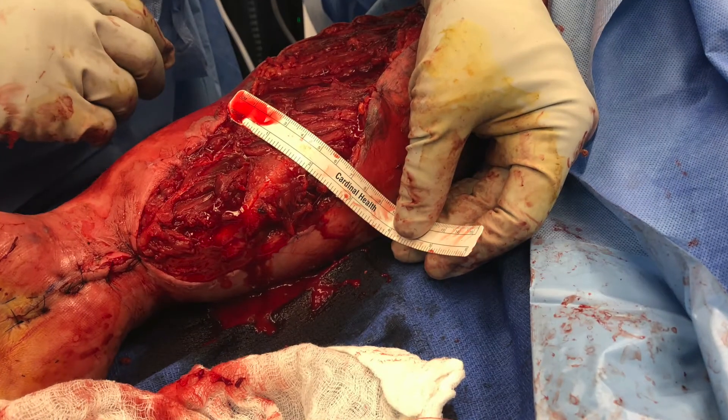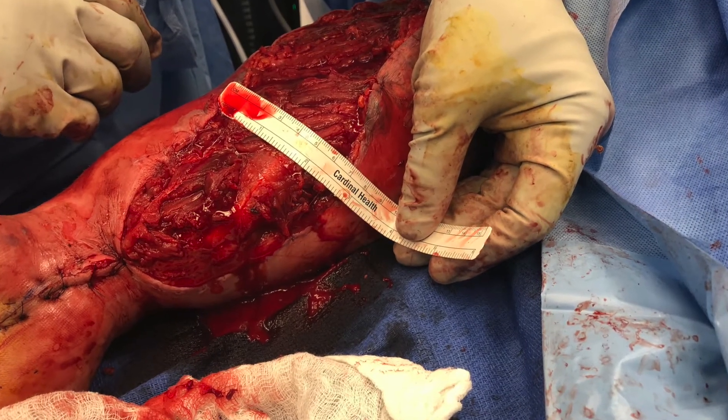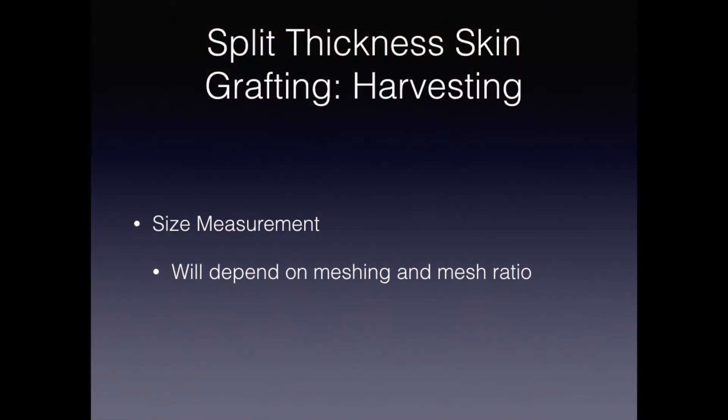Now we measure the recipient field after this has been adequately debrided and prepared. Measurement will have to be adjusted while drawing this on the donor site if using meshing. The adjustment will depend on the meshing ratio.